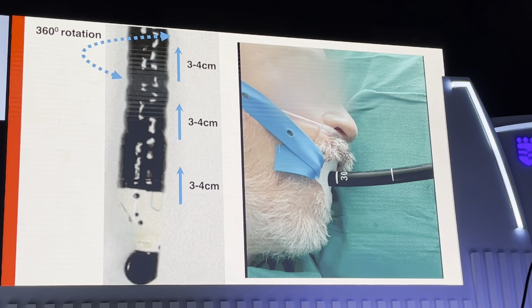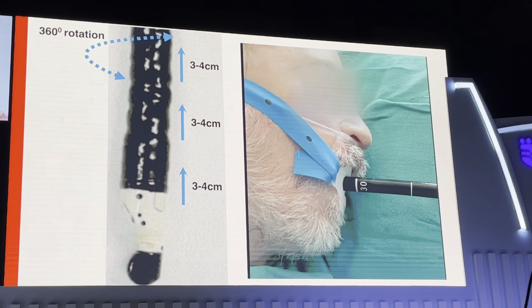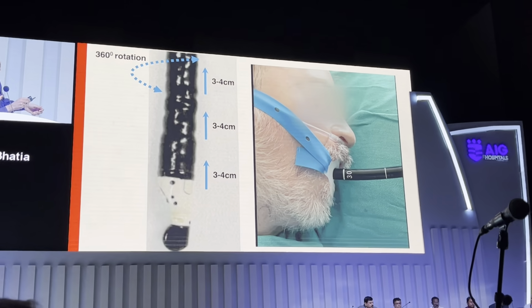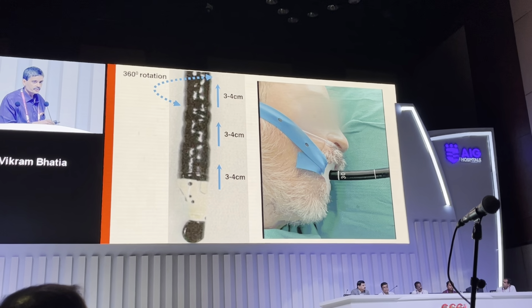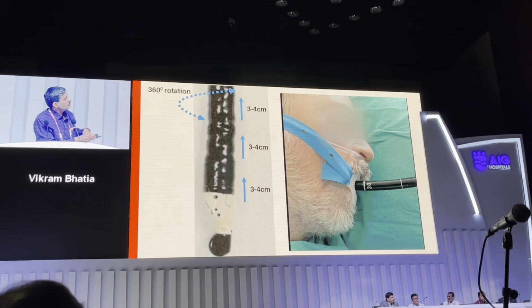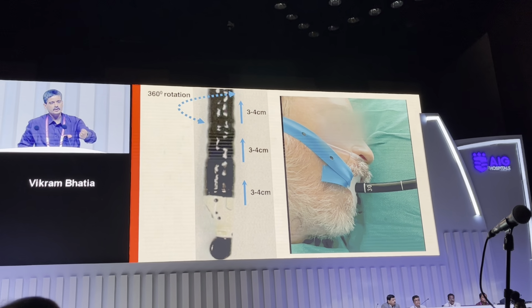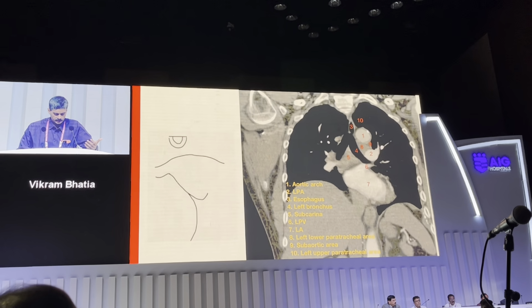So what you do for the esophageal imaging is you go down into the stomach, suck out the residue, and image as you withdraw. And the logic is that the scope is now straight, and every 3 to 4 centimeters you are supposed to go 360 degrees from one side to the other. As you rotate, the scope has a tendency to be pulled out, so you keep a watch, or you ask your nurse to watch the markers at the patient's mouthpiece, which tell you that you are rotating at the same level. This is a useful clue for beginners.